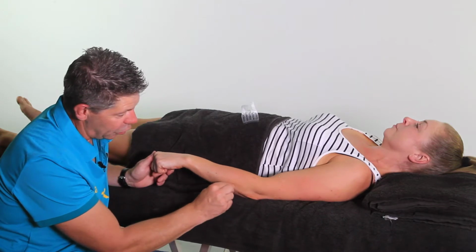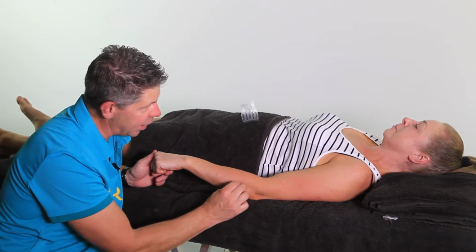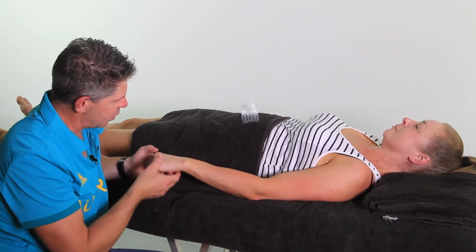So what you see, the ulnar bone's right here, so we're not going to needle the ulnar bone, okay? I think we all know that. So we're just going to stick to the soft tissue of the extensor carpi ulnaris. All right, you can relax.